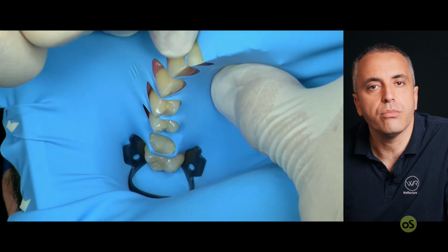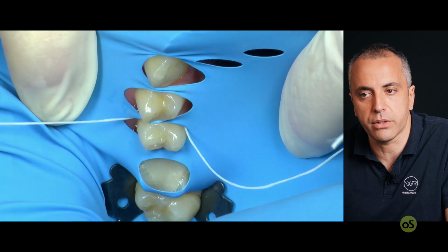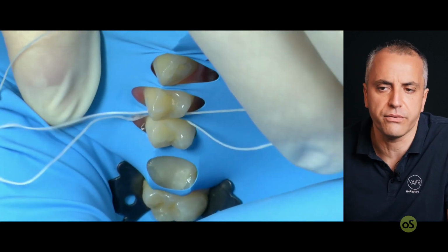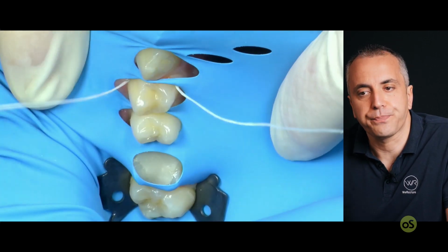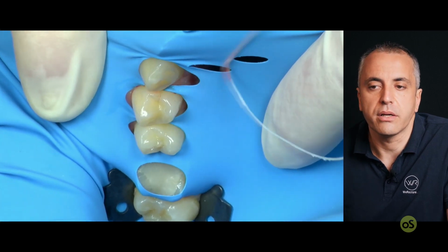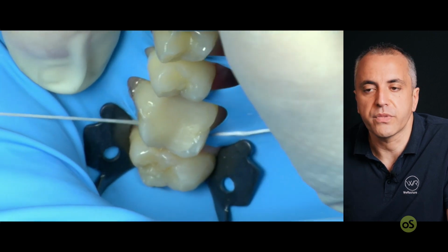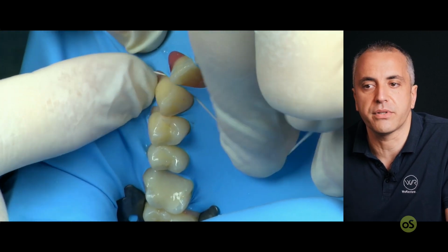As soon as possible, we go medially and find a block medially, a counter block. If we find it, it's much easier. If we don't find it, we proceed with the passage of the rubber dam underneath the interproximal contacts. So single floss, double floss. Sometimes some interdental contacts are very tight, some are loosened.